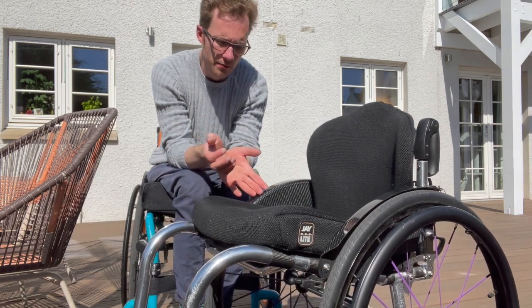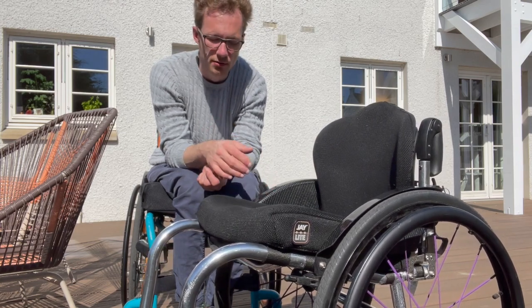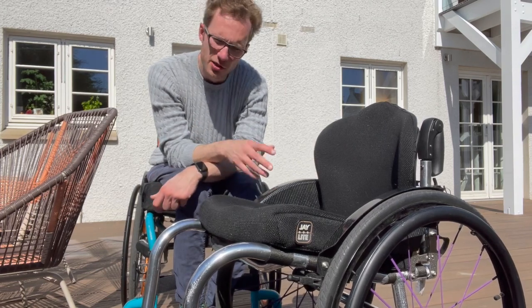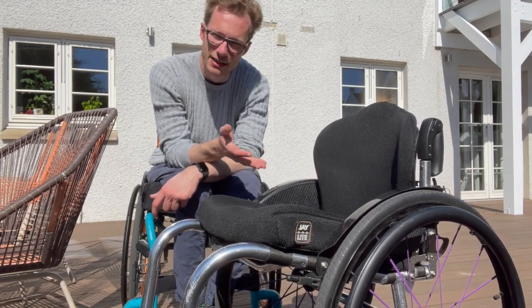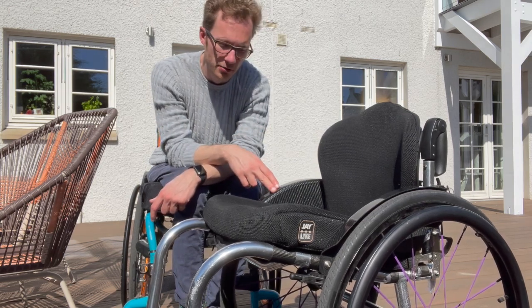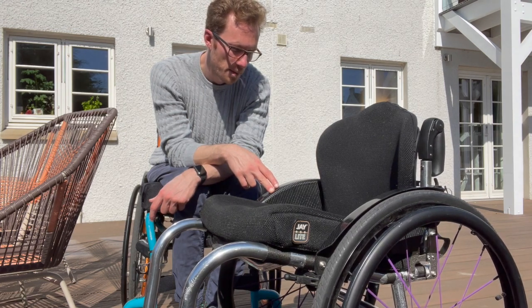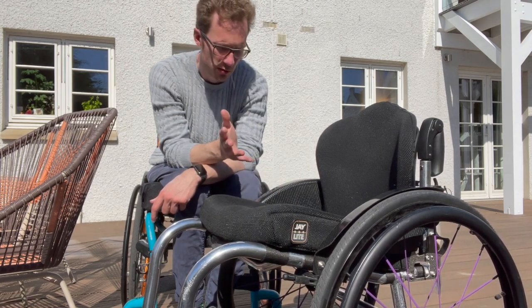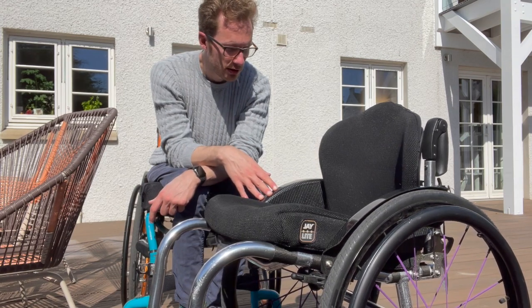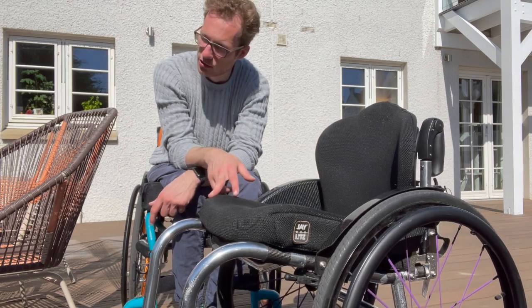An advisor from RGK usually comes to measure you, and in my case the advisor was a chair user himself, which gave me a lot of confidence that he actually knew what he was doing and talking about. There are certain things you can only really understand if you experience them, and one of those is actually being a chair user — so he appreciated the sort of things that were important to me.